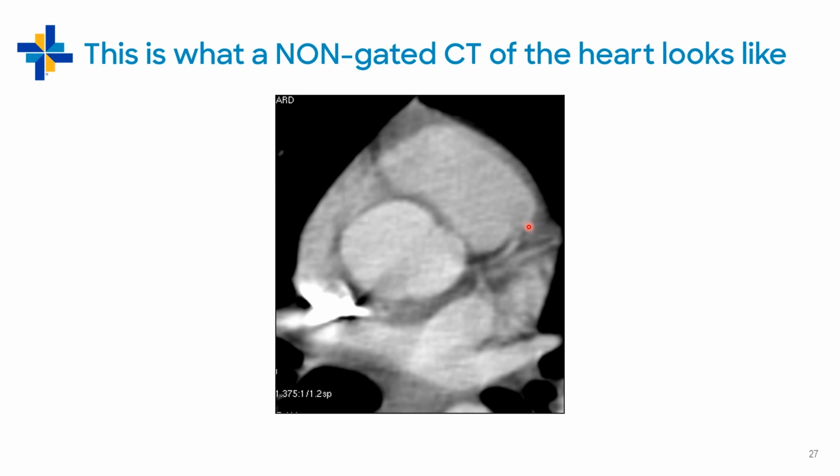And so it was kind of ignored up until we started. The heart was ignored on CT scans up until we started getting very, very fast, initially EBCT and then spiral slice CT.